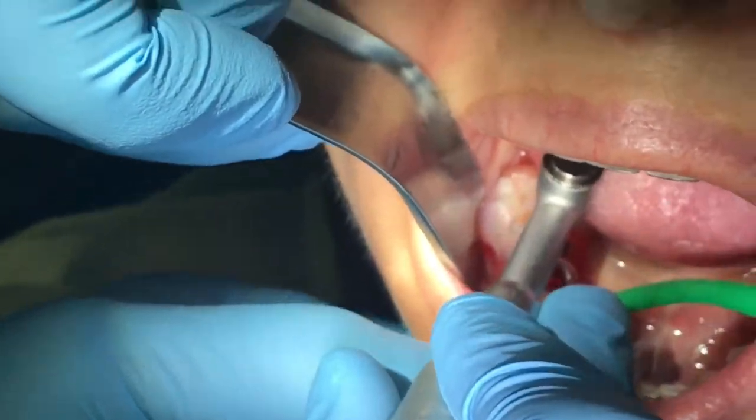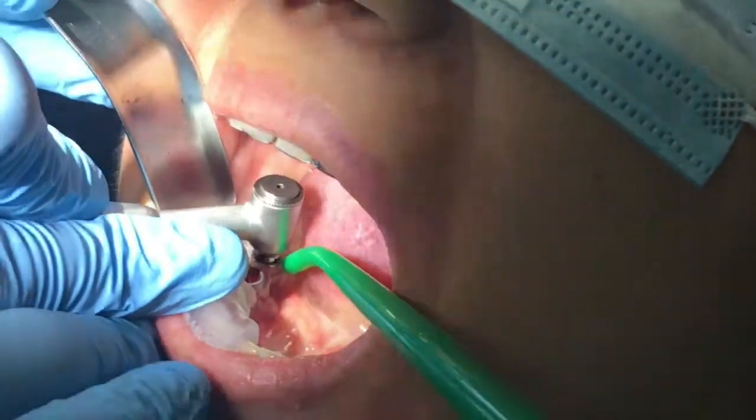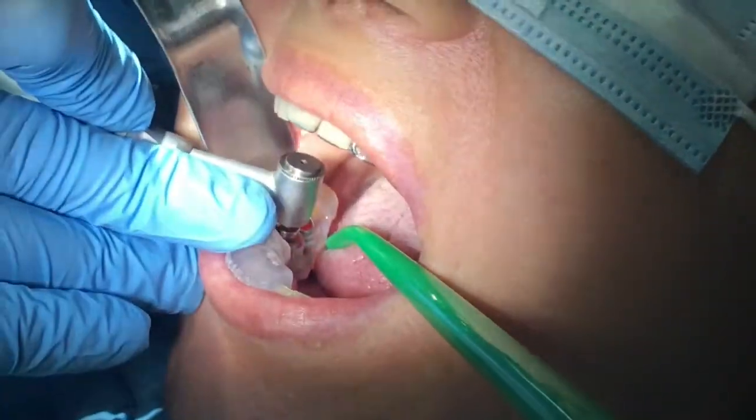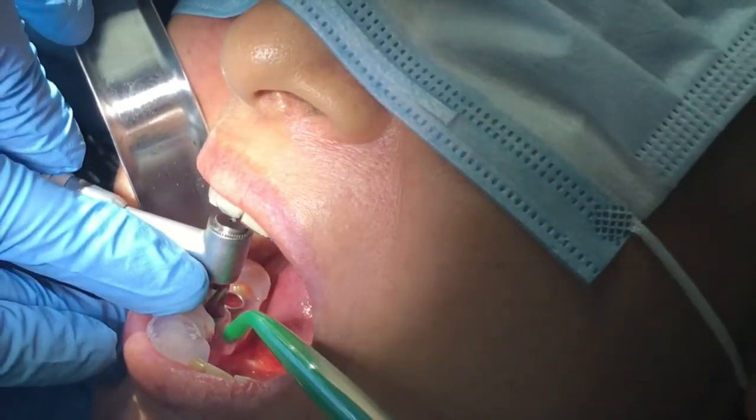In this protocol we are drilling at 1200 RPM. What you see here, we are working on tooth number 30 and 31, and we are going on both sides simultaneously. We have a great view of where the pilot drills are going right now.